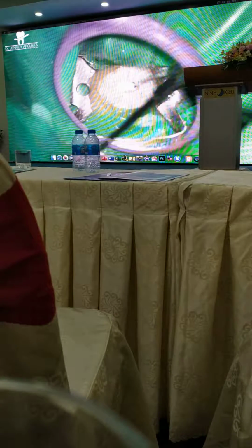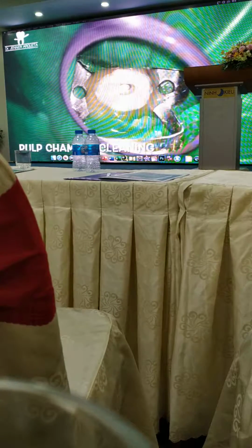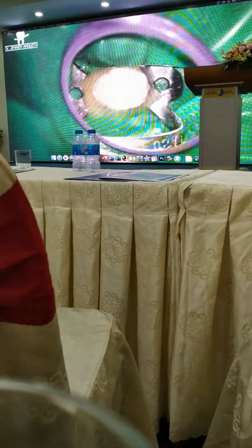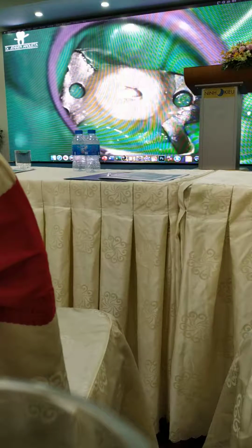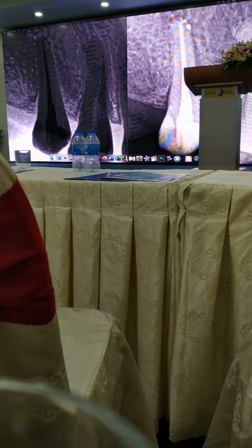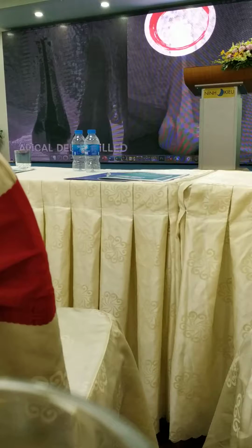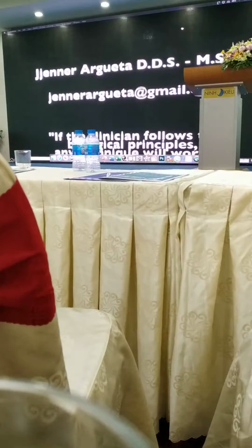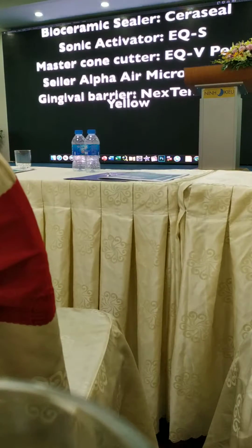After that, you just need to compact, and I want you to pay attention to the apical third of the root in the final X-ray. I use the AQS for cleaning the pulp chamber, and look, can you see? We were able to fill that ramification in the apical area just using one master cone and the sealer.